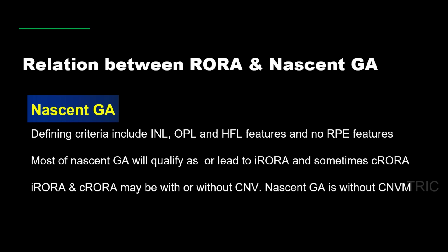So friends, this was all about new terms in dry AMD. As newer therapeutic modalities are being evaluated for management of dry AMD, understanding these terms is vital.